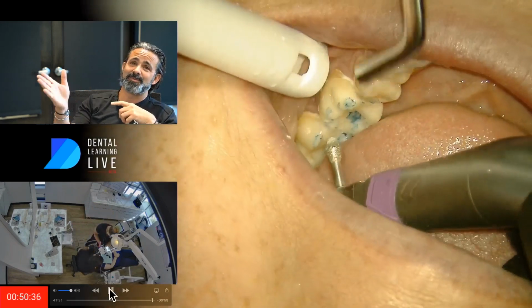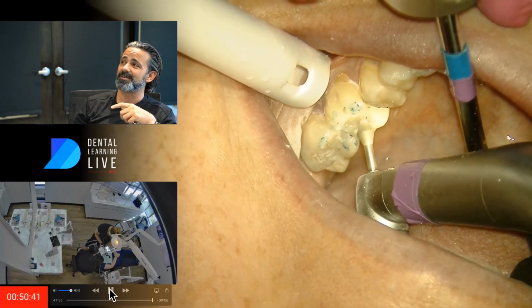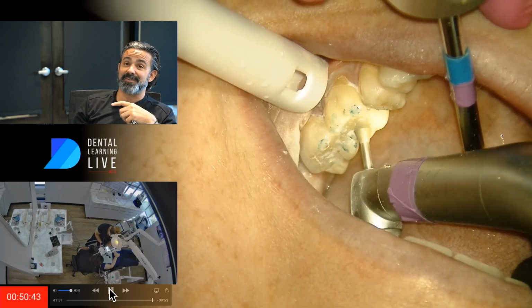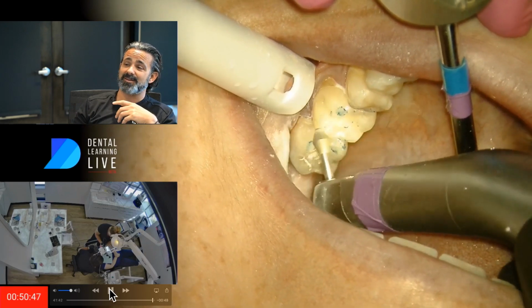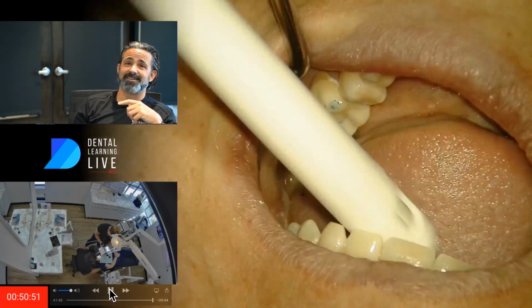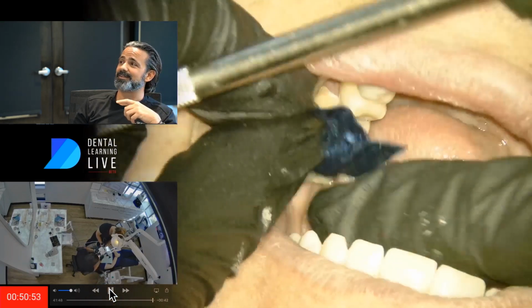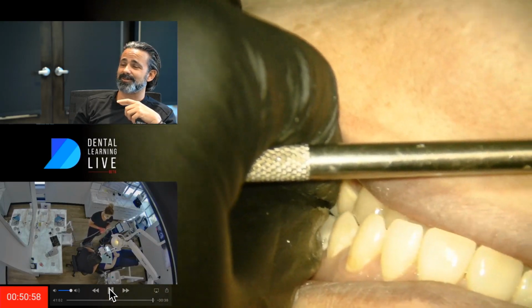Sometimes if you go back and look at my working length, at least you can see the cannula on the 2D x-ray, the working length x-ray. But if you can't see that or the assistant doesn't capture that on the x-ray, you could forget it and send a patient home with that cannula. And patients will think they grew another tooth back there, and it's not, it's your port. So don't do that. Have a protocol.